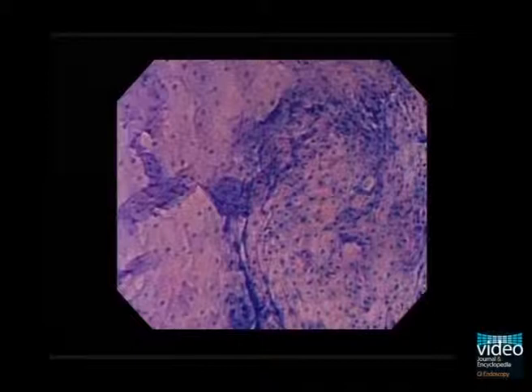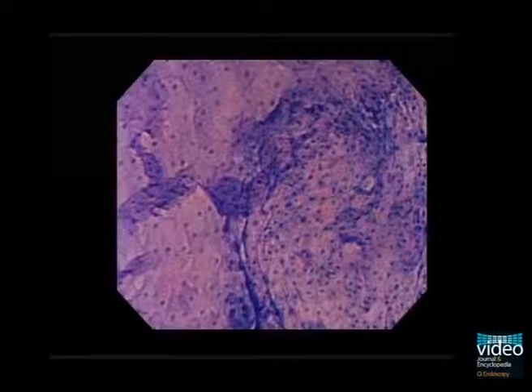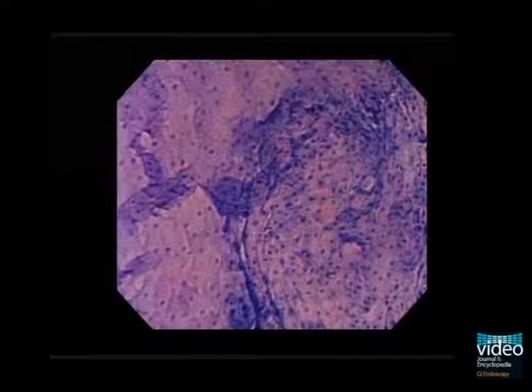In the actual video clip, we can see a very clear border between the background epithelium and the region. The left half of the image shows background non-neoplastic mucosa, while the right half demonstrates low-grade intra-epithelial neoplasia.